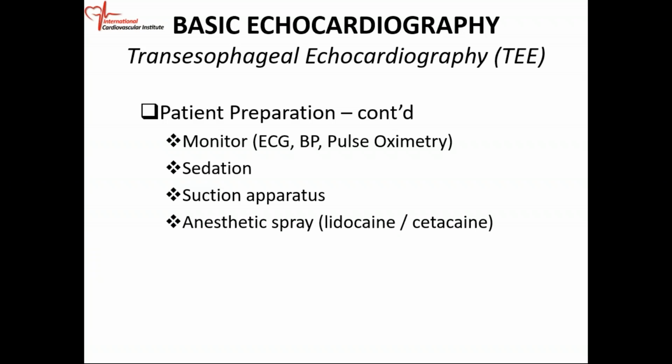If you don't have a pulse oximeter on, you won't know that. You might think the patient is just sleeping and very cooperative. So make sure you have your necessary monitors: ECG, blood pressure, pulse oximetry.